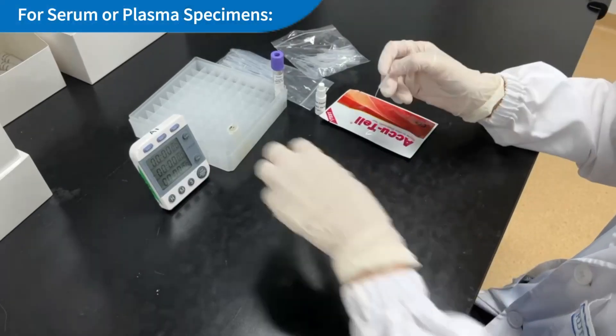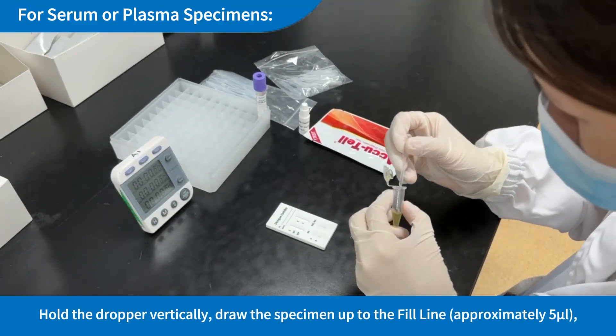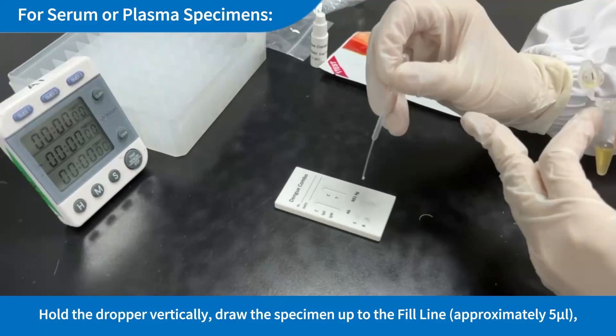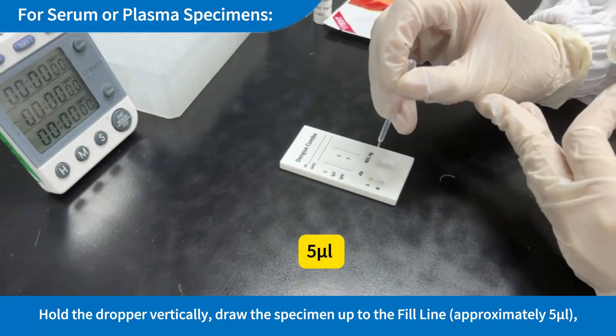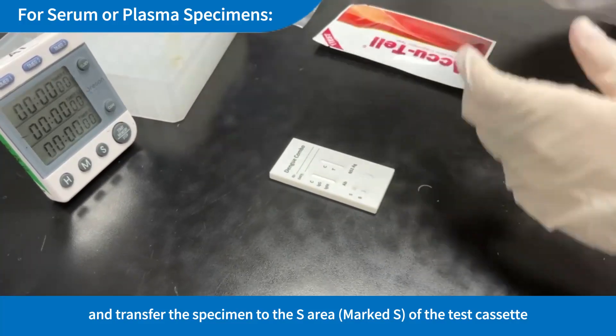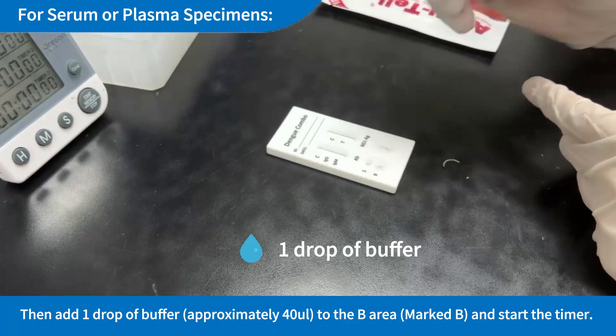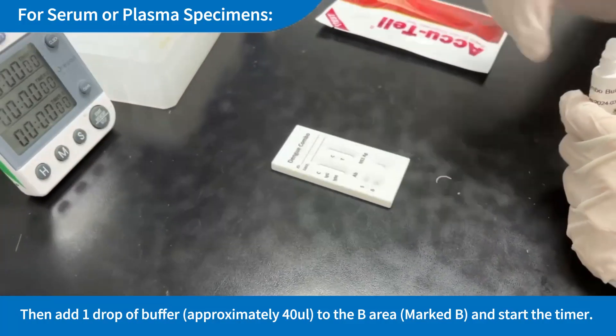Serum or Plasma Specimens — To use a 5µL dropper for Dengue AB: Hold the dropper vertically, draw the specimen up to the fill line (approximately 5µL), then transfer the specimen to the S area (marked S) of the test cassette. Then add 1 drop of buffer (approximately 40µL) to the B area (marked B), and start the timer.